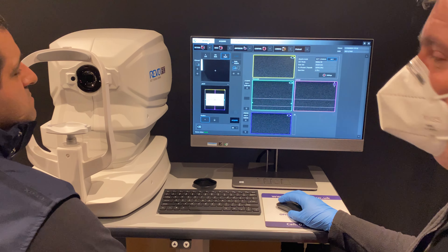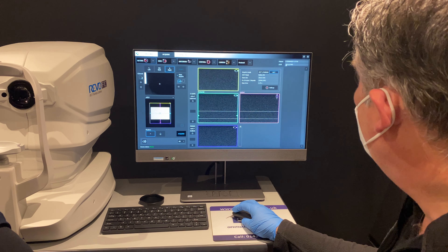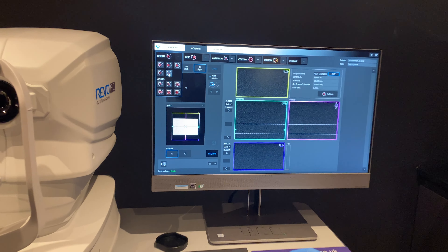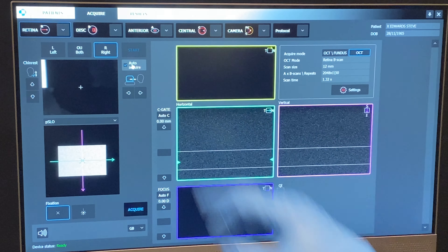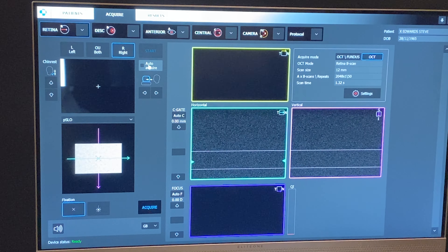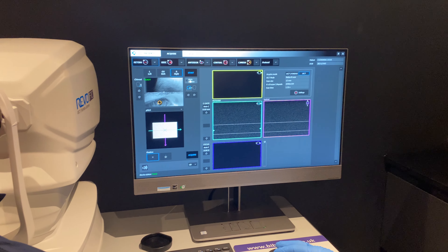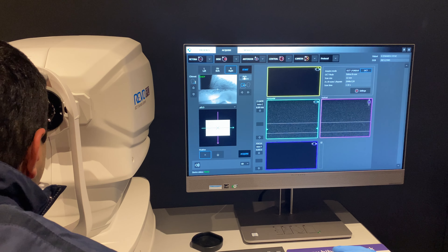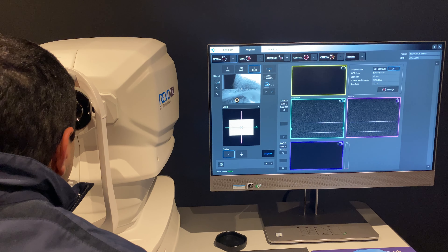I'm just going to do it under my patient name. I'm going to go to acquire single B-scan and take it off full auto, so I'm going to be on semi-auto. If you can pop your chin on the chin rest and head against the forehead rest — you won't be able to see it at the moment, but in a minute you'll see a green fixation cross. I'm going to press start.